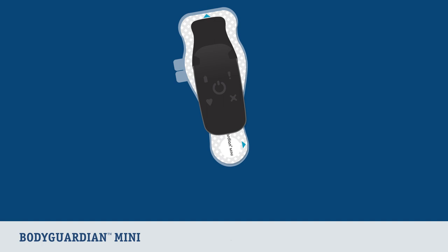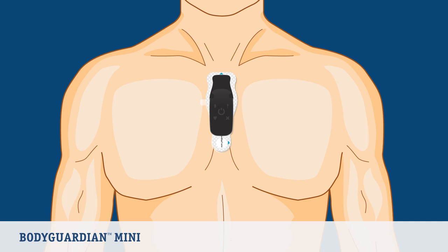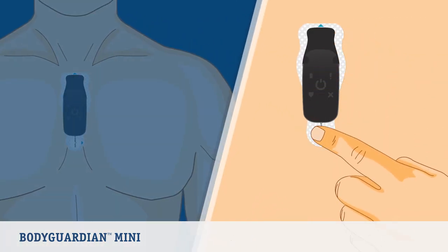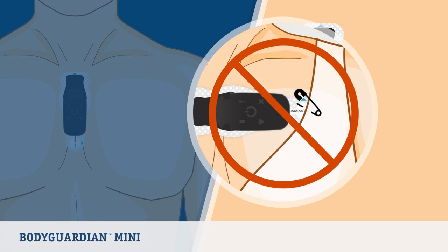To attach the strip to your chest, hold the monitor and strip assembly by the monitor. It is recommended to peel away backing number one from the strip, then place that section of the strip with the adhesive exposed flat on your chest. Once applied, slowly peel away backing number two from the strip as you press the strip flat on your chest. Press around the surface of the strip against the skin to ensure the strip adheres. Make sure the strip is flat and smooth on the skin — do not wrinkle the strip and do not pin it to a bra or clothing.